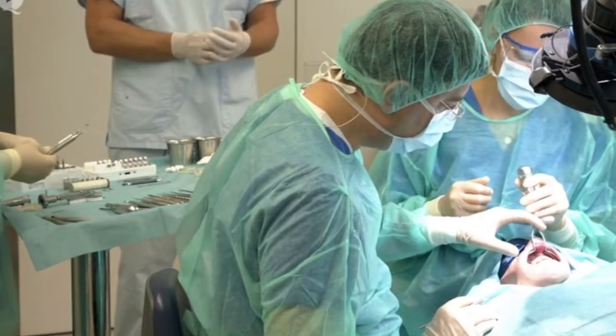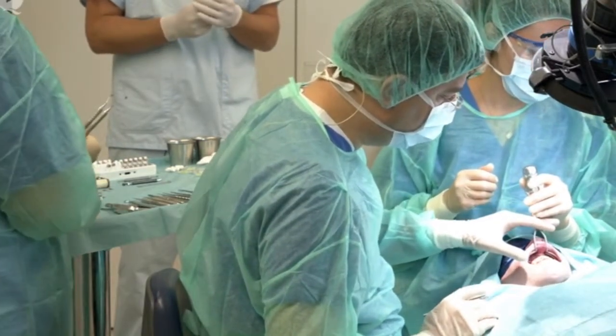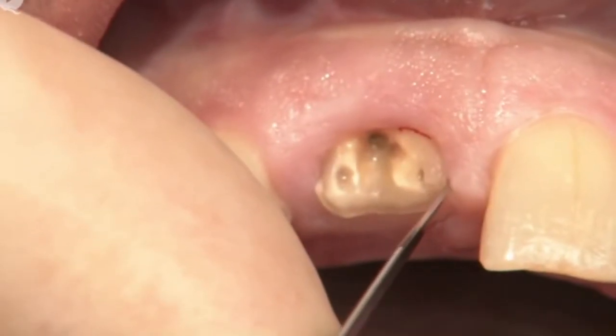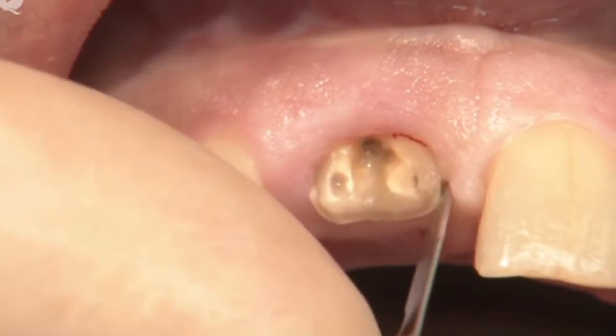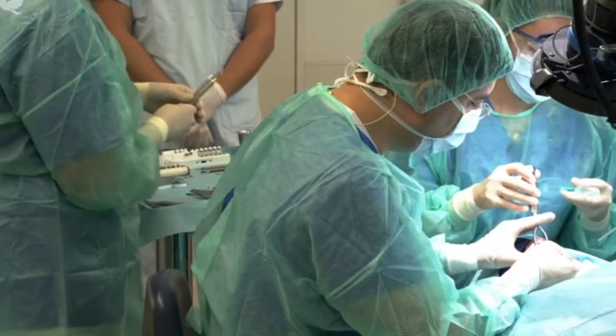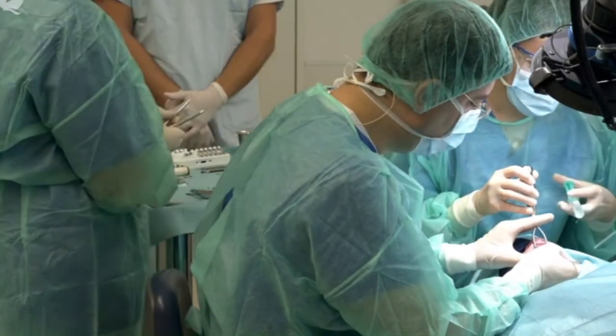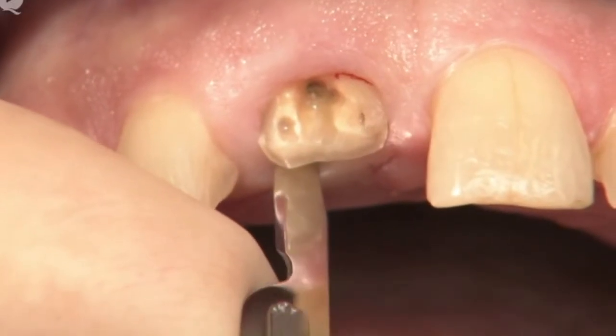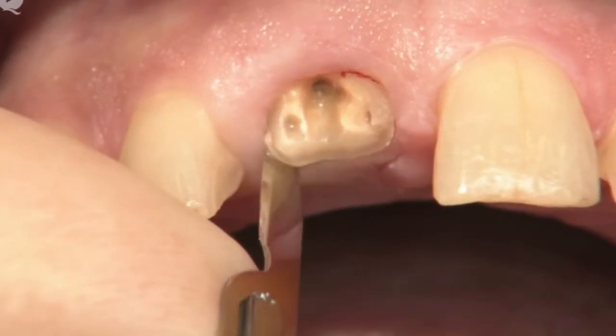The anesthetic has already been injected so we can start to sever the dento-gingival complex with a 15c scalpel blade on the palatal. It is important that I have a safe support for my hand. Then I can carefully move all the way around the tooth.